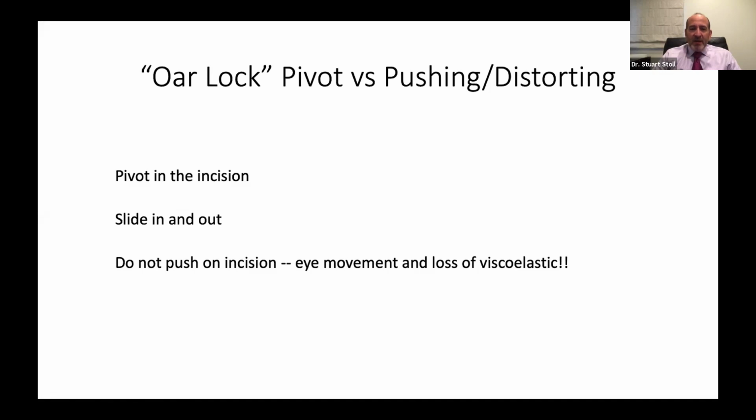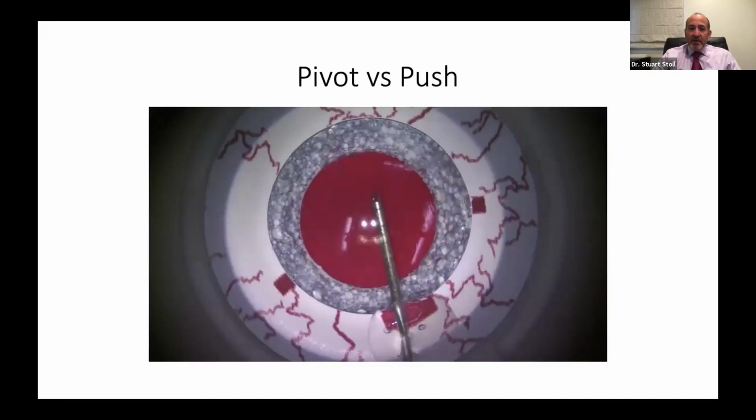They've been so good, and now all of a sudden they're looking around right when I need them to hold still, and I'm trying to go over here and do something and grab the capsule. Now the patient's moving. Well, they're not moving. You're moving their eye. You're pushing on the incision. You're lifting up, or you're pushing to the side. So let's watch that here.